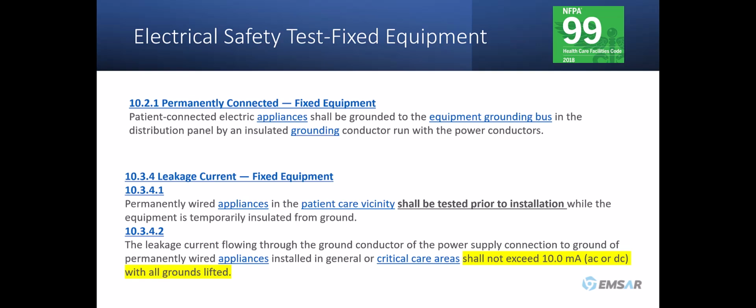If we needed to test this afterwards and not unwire it, then we could use a continuity test using our Pronk safety analyzer or a multimeter. Common devices that are hardwired into the facility are your surgical lights. Now, they used to actually hardwire blanket warmers into the facility, but that's a practice that has gone away.